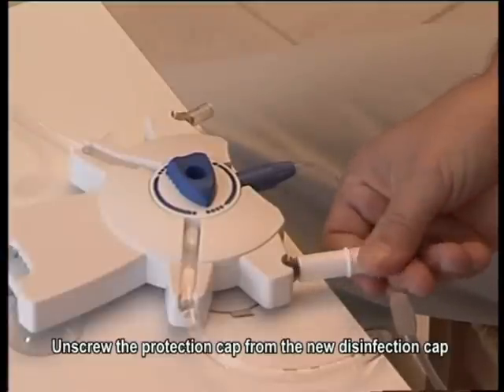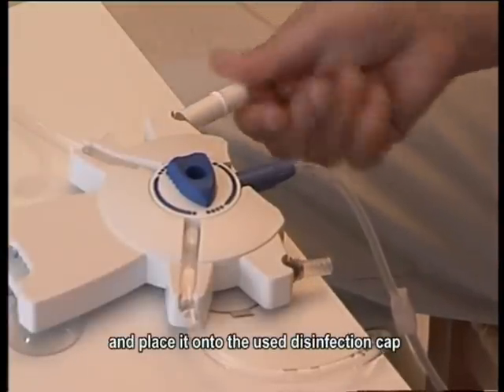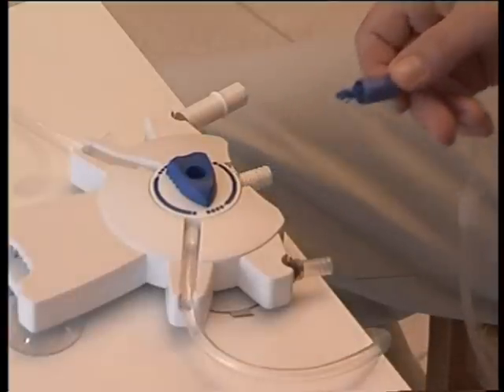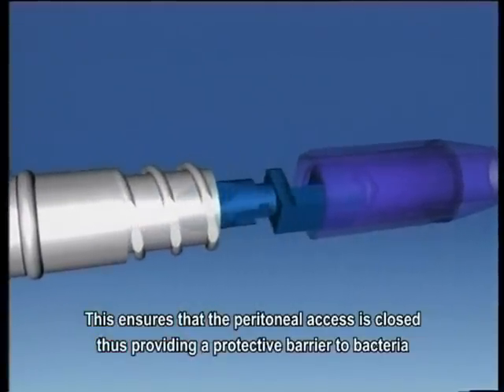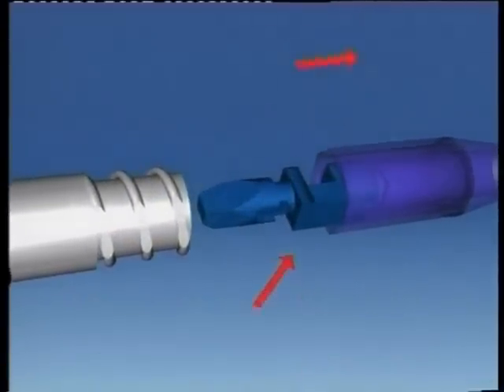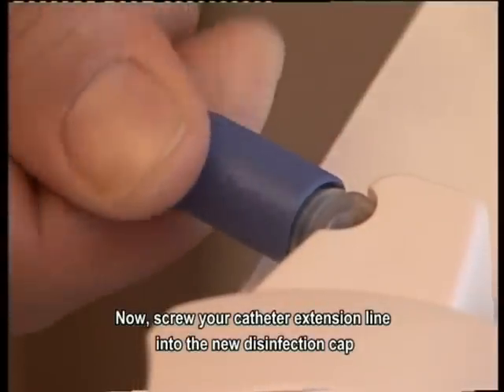Unscrew the protection cap from the new disinfection cap and place it onto the used disinfection cap. Unscrew your catheter extension line from the disc. The pin will be in the catheter extension line. This ensures that the peritoneal access is closed, thus providing a protective barrier to bacteria. Now, screw your catheter extension line into the new disinfection cap.